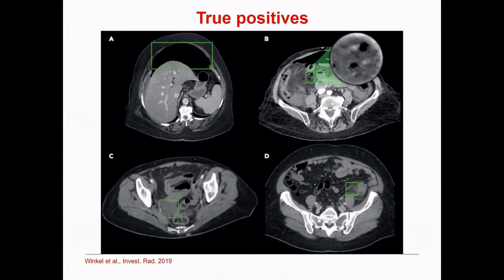The whole process takes 3 minutes from the finishing of the images to the finishing of the algorithm. And we get, again, a structured list of those boxes and their findings. We can say yes, no, yes, no, yes, no, and say what it could be else. And with that, we already create the next database for a retraining of such an algorithm.